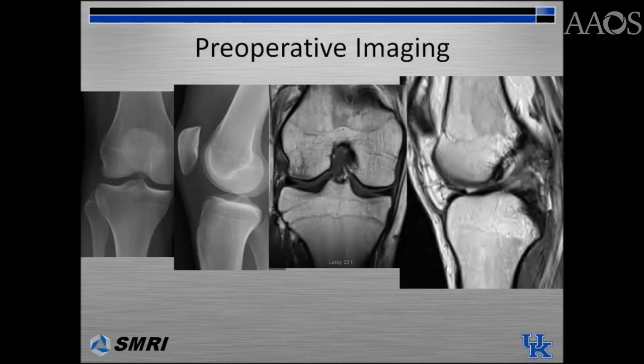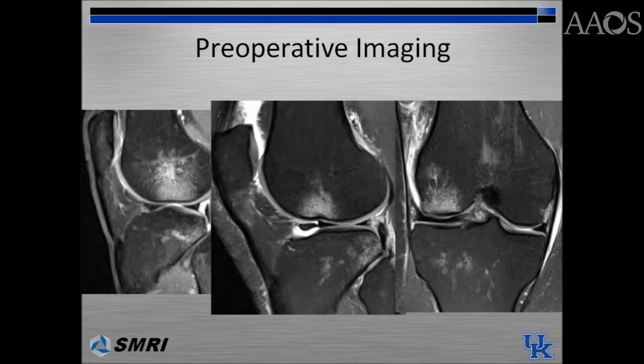Preoperative x-rays and an MRI are shown here. The anterior cruciate ligament tear can be seen clearly on the coronal and sagittal MRI images. Pathognomonic ACL tear bone bruises are seen on these MRI T2 images, in the middle one-third of the lateral femoral condyle — also known as the sulcus terminalis — and the posterolateral tibia.